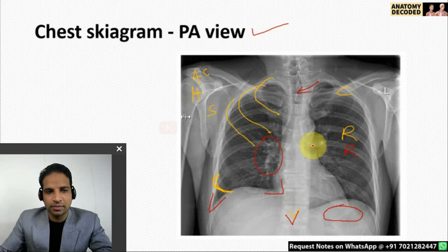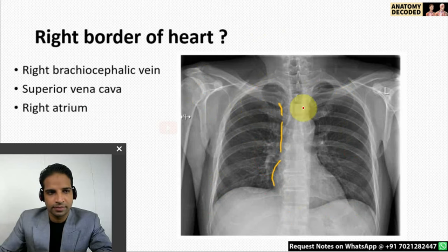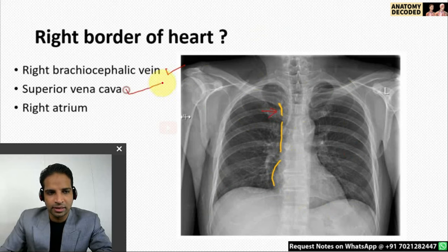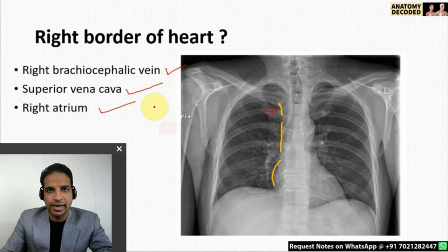Let us cover the cardiac border. Looking at structures forming the right border of the heart from superior to inferior: there is the right brachiocephalic vein in this region, then the superior vena cava, and then the right atrium. These three structures form the right border of the heart.